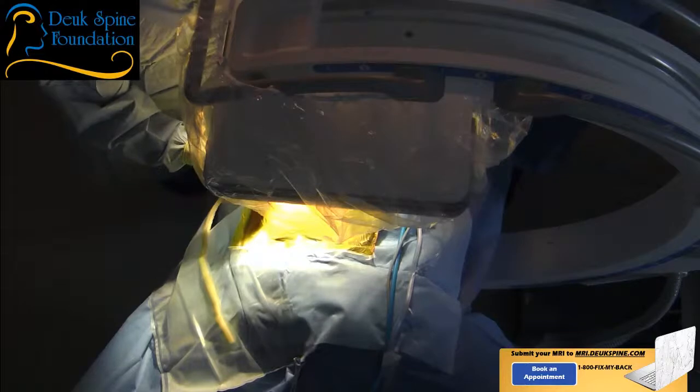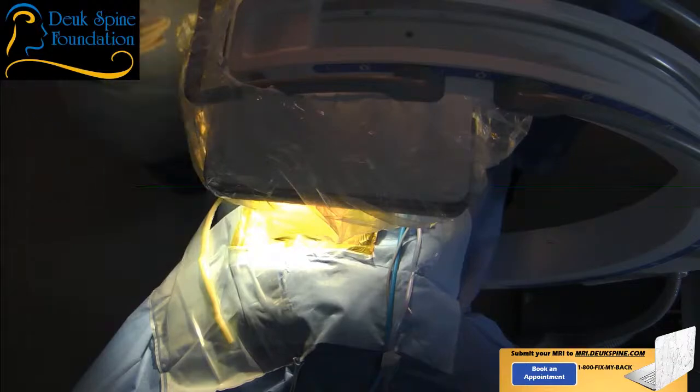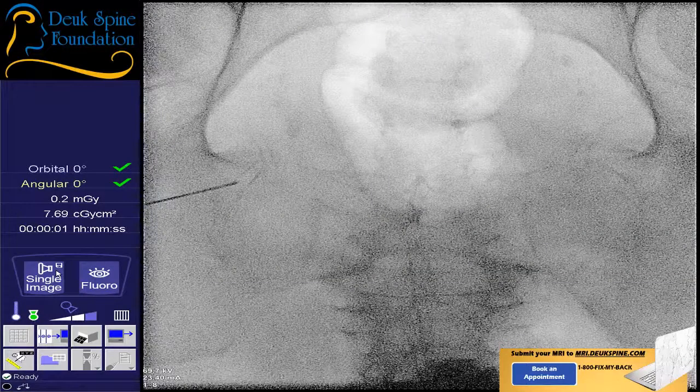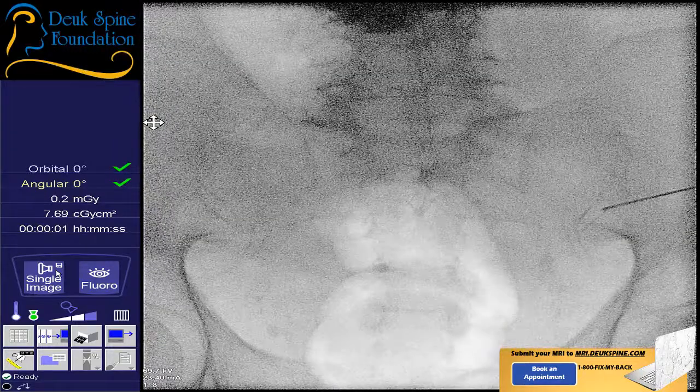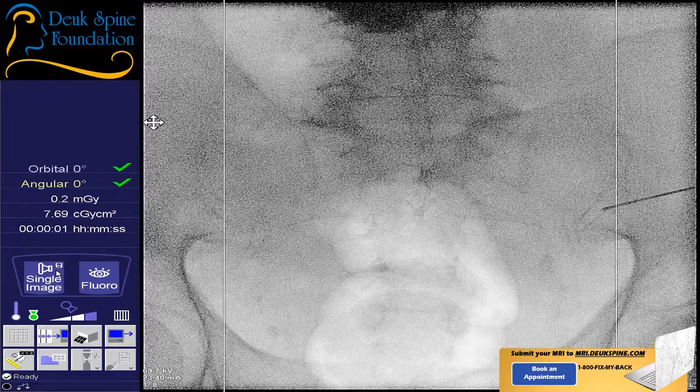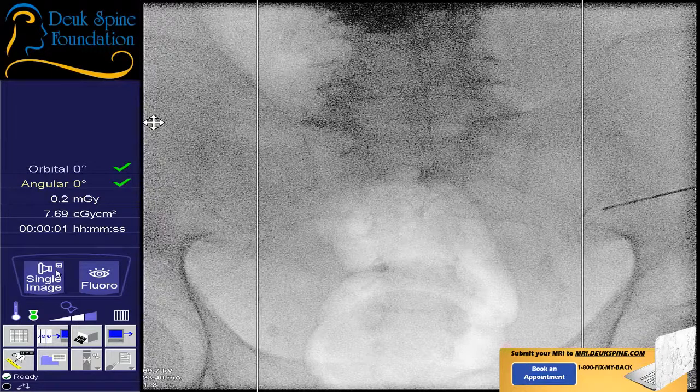All right, try to lay still, okay? I'll do my best to make you comfortable. Shot? So we're going to use this x-ray machine and navigate. We're pretty low. I think we're going to need to go a little bit higher. Let's see. Yeah, we need more local.